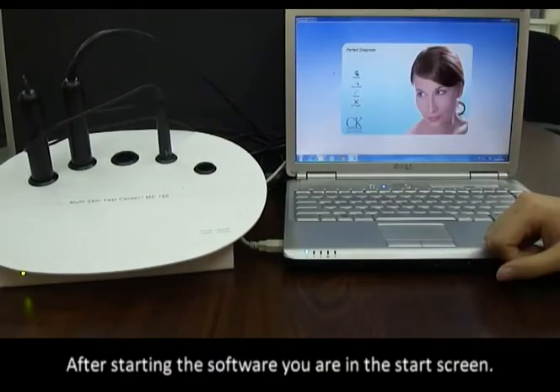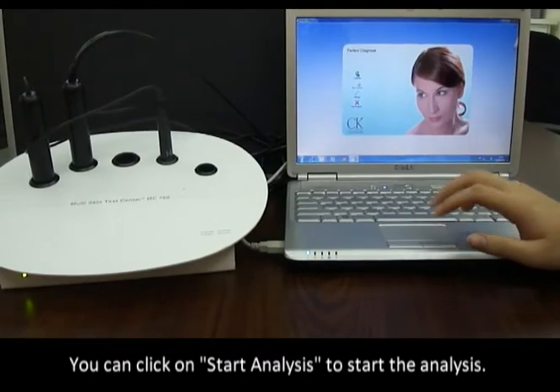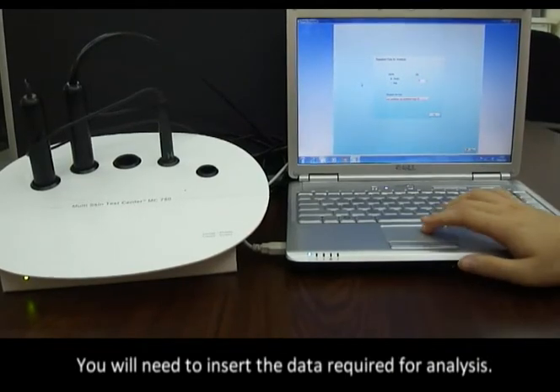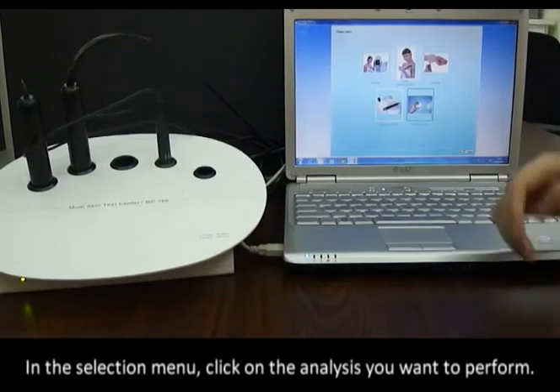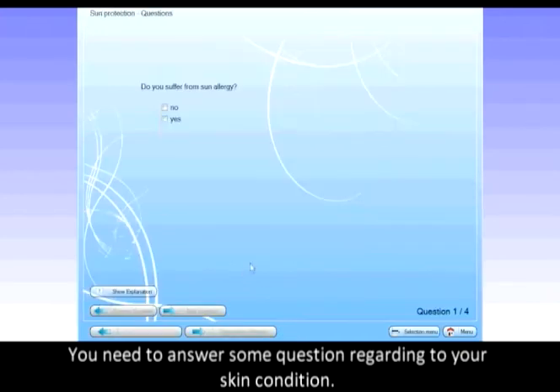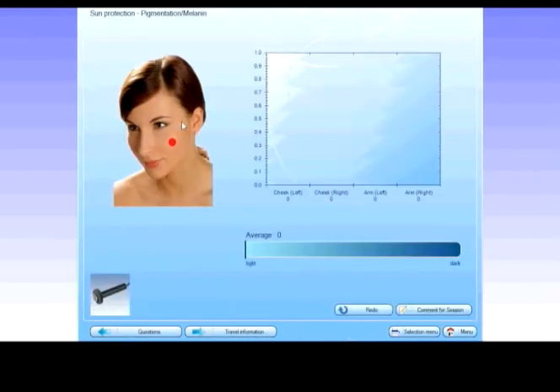After starting the software you are in the start screen. Click on 'Start Analysis' to begin. You will need to insert the data required for analysis. In the selection menu, click on the analysis you want to perform. You need to answer some questions regarding your skin condition. You can enter your own questions and answers to tailor the software perfectly to your individual needs.